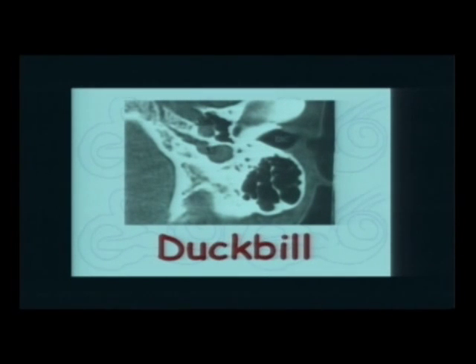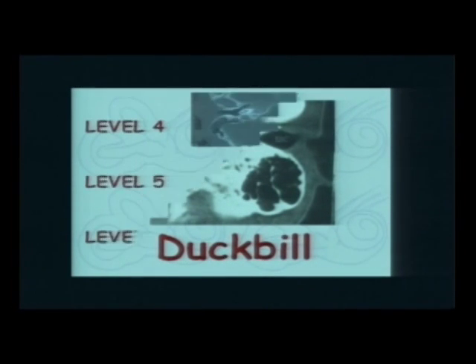Another nice appearance of the duck bill. This is the body of the duck, the head of the duck, and the beak of the duck. And this is a cut where you are just missing the legs of the duck. And this is quite a high jugular bulb, in which the jugular bulb is sliced at this level, so it's not seen opening into the jugular vein posterior of the jugular foramen.